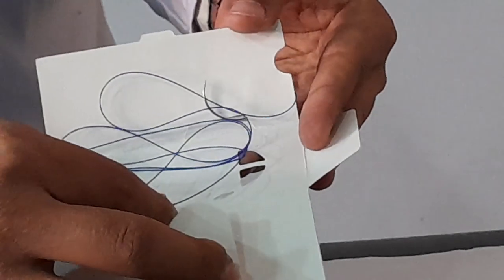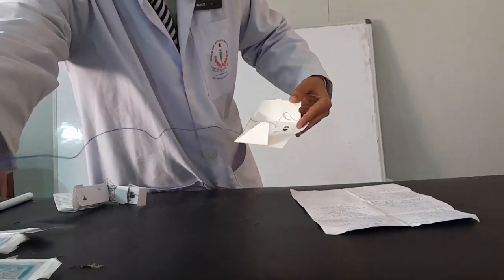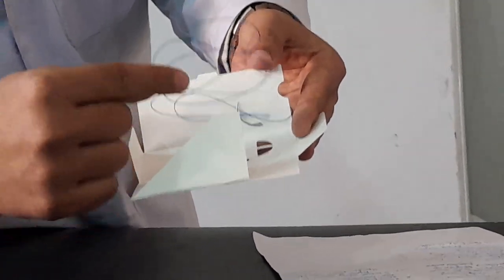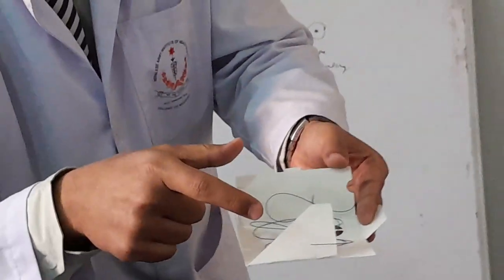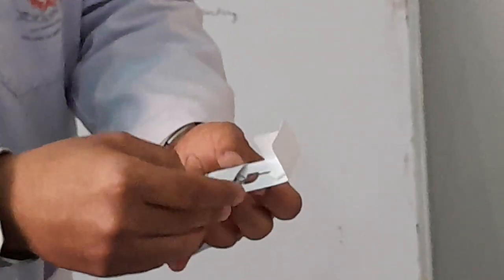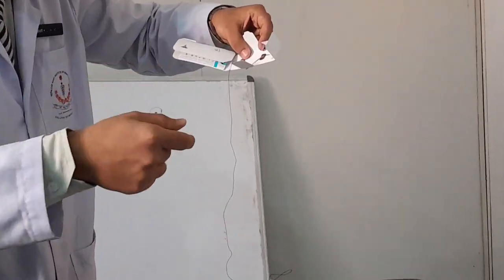Now if we take this monofilament type of suture material out, and then I leave it, you see it again tends to maintain its original position, isn't it? So it is said that it has memory. When it tries to recoil or regain its previous packaging position, it will be difficult to make the knots. However, this is a multifilament type of suture material. I take it out and see, it does not recoil back, isn't it? So for me, it will be easier to make the stitches and knot it.